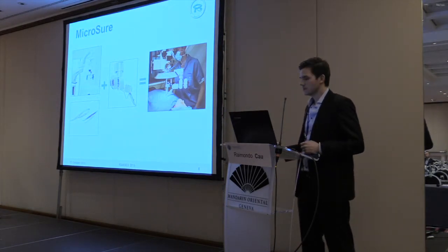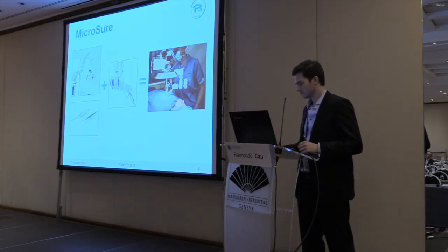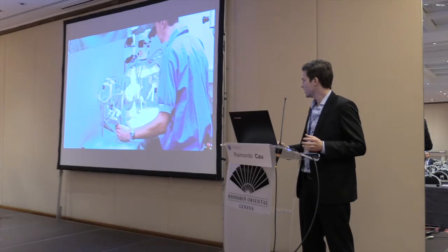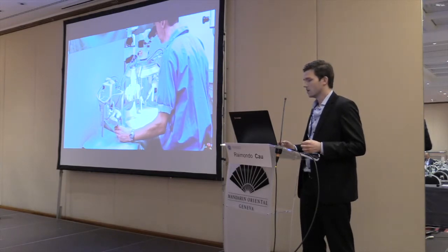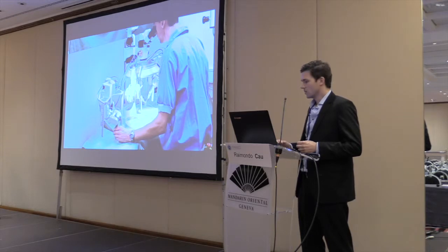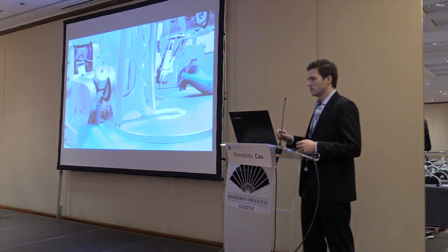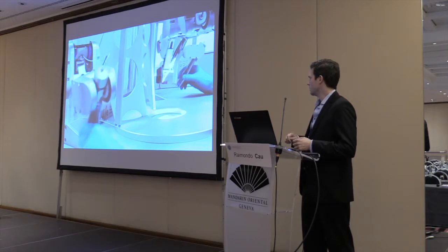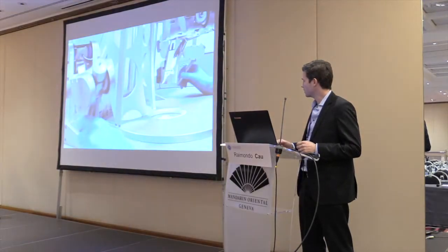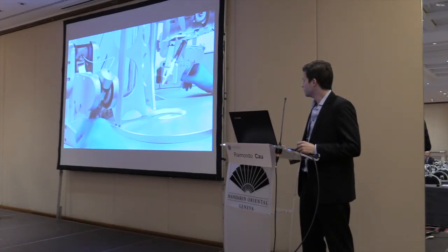So this is basically the concept in a nutshell. We use the existing microscope, we use the existing instruments, we add a robot, and then we get this. Here you see a video of the first prototype. So the surgeon has a left and right hand joystick. We can apply a motion scaling of 1 to 1, which you want to use when you want to do fast movements. But you can also switch to a more precise movement when you apply a motion scale factor of 1 to 7, 1 to 10. It's basically just a button that you can turn. When you want to be more precise, then you turn up the motion scaling, and when you want to be faster, then you turn it down again. So here you see the large motion scaling, 1 to 7.